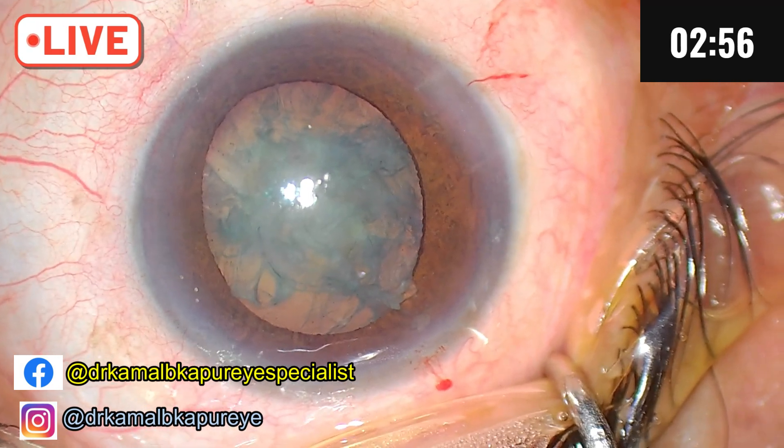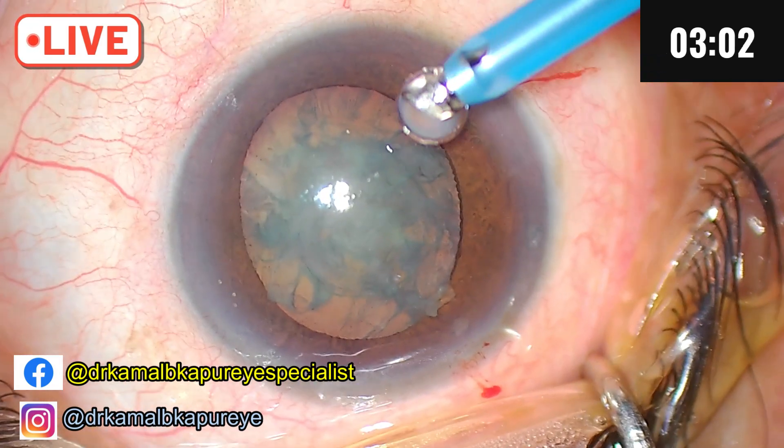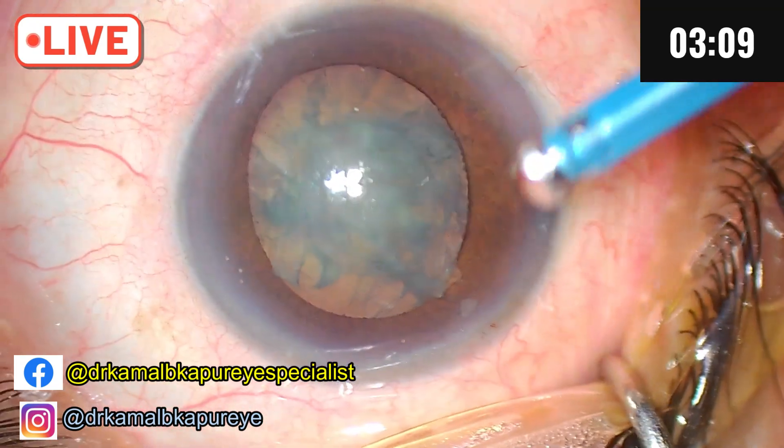If you will notice, I made a slightly increased size of my side port because I want some kind of leak at my will whenever I want. Since it's a little soft cataract, I will reduce the tip exposure here.